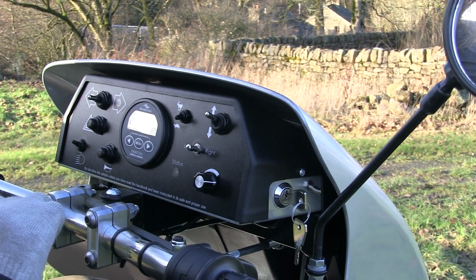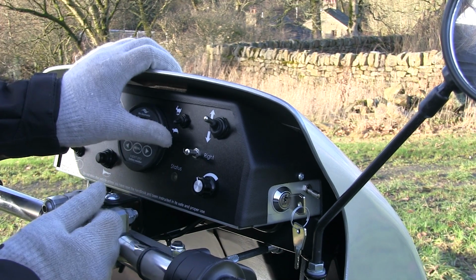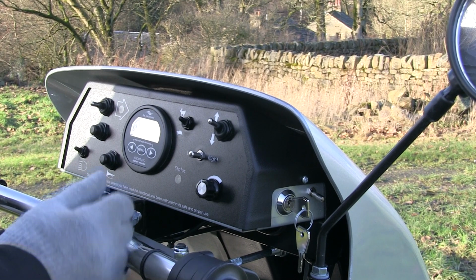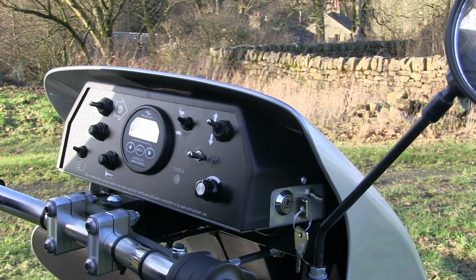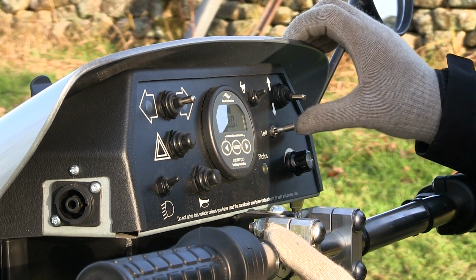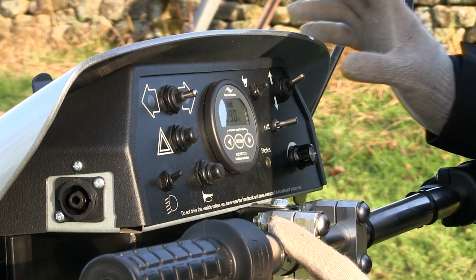If you get more confident, the best thing to do would be to turn that speed down whilst in tortoise, but then you can move into hare just by clicking the switch. You can then adjust your speed to make it a much more comfortable speed for you to be moving forward in. The first thing to do is to select whether or not you're moving forwards or backwards. Usually you'd be starting in the forwards position, but if you do need to reverse, it's up for forward, down for reverse.